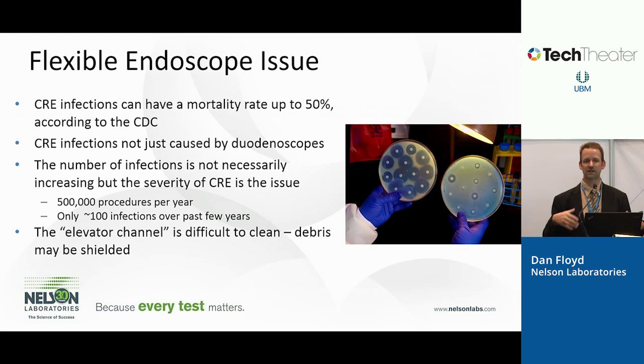These are devices that are cleaned and then re-sterilized and used on the next patient. So they use them on one patient, they reprocess them, and use the same device on the next patient. They're very expensive. In some cases they're $40,000, $50,000 a unit. So obviously they can't make them single-use devices. So they have to be cleaned and re-sterilized. And what they found is some of these are very difficult to clean, and that's where they found out.